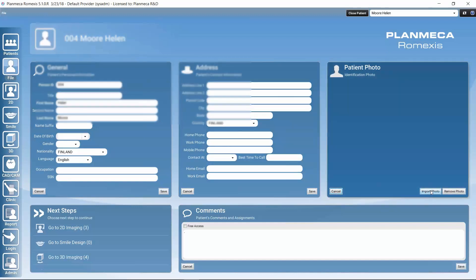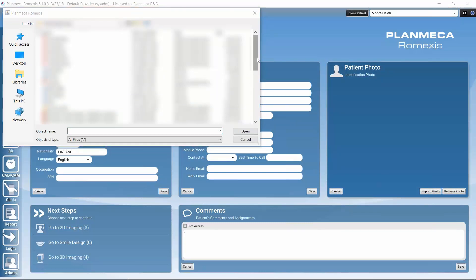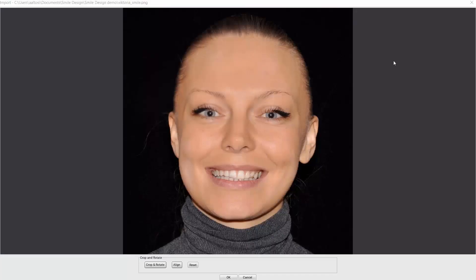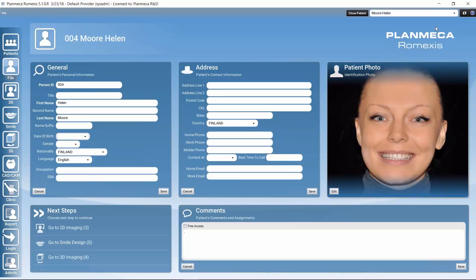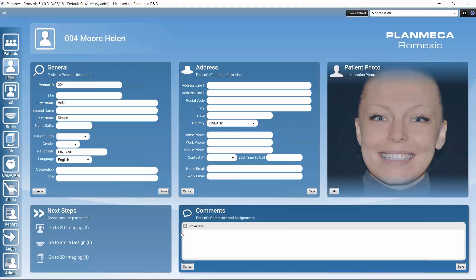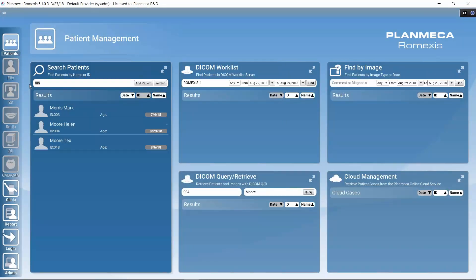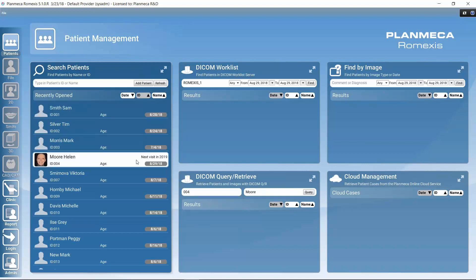We can also import an identification photo for the patient. Clicking 'Import photo,' selecting a photograph, and clicking OK imports the image — we can adjust it slightly if desired. Additionally, a free-form comment can be added for the patient. After clicking Save, closing the patient and refreshing shows the identification photo and comment have been successfully added.